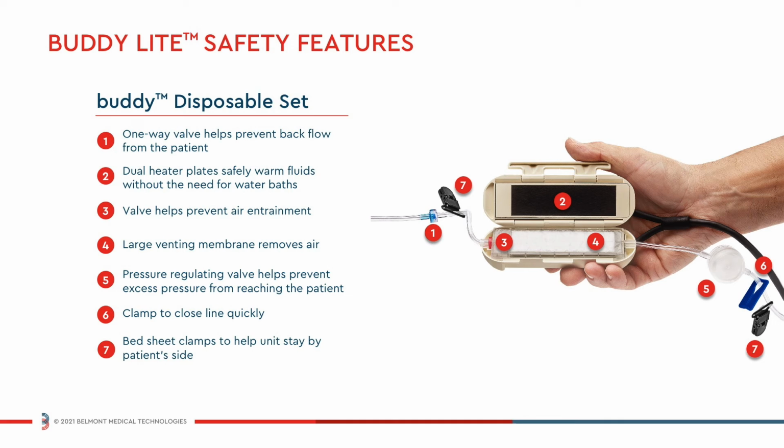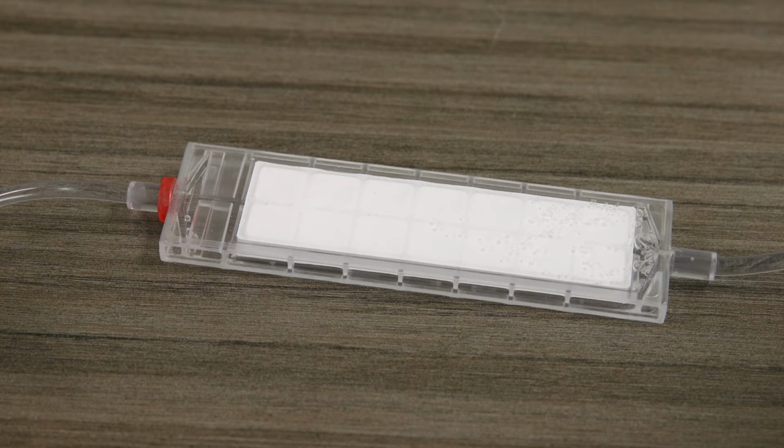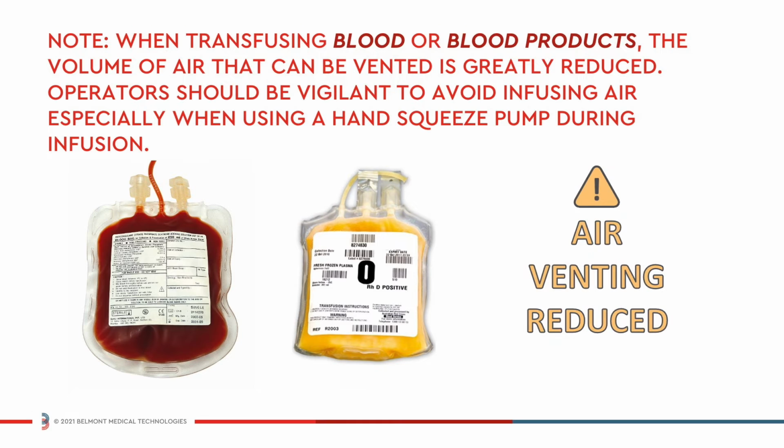The Buddy disposable set is equipped with multiple safety features that can help protect the patient from unsafe operating conditions. As crystalloid solution travels through the disposable set, the microporous membrane located within the disposable automatically vents air. When transfusing blood or blood products, the volume of air that can be vented is greatly reduced. Operators should be vigilant to avoid infusing air, especially when using a hand squeeze pump during infusion.